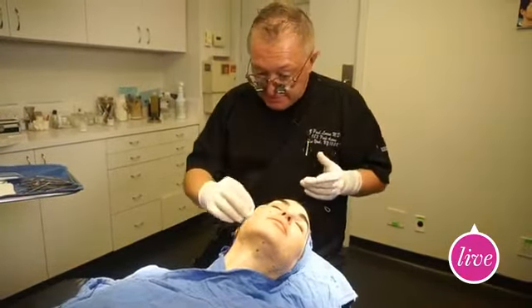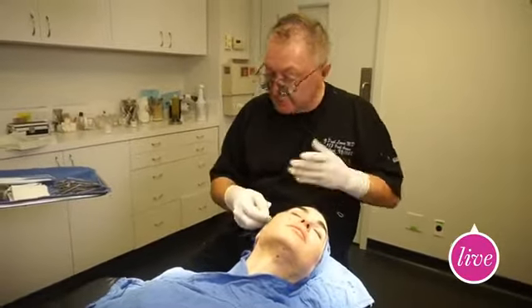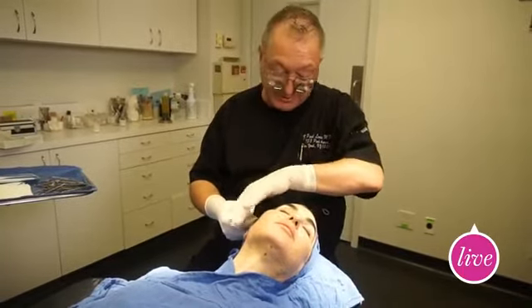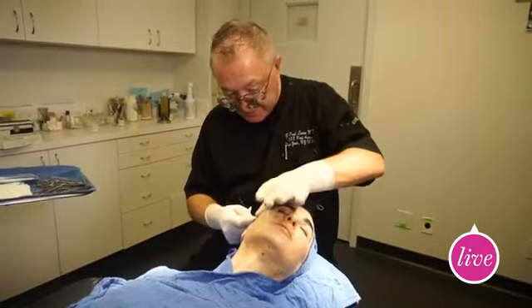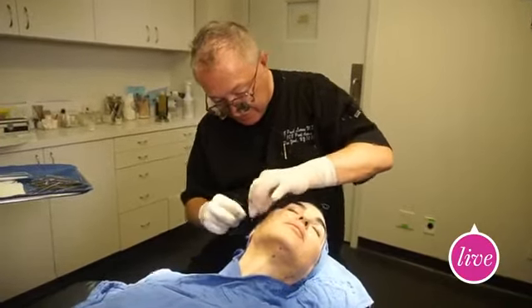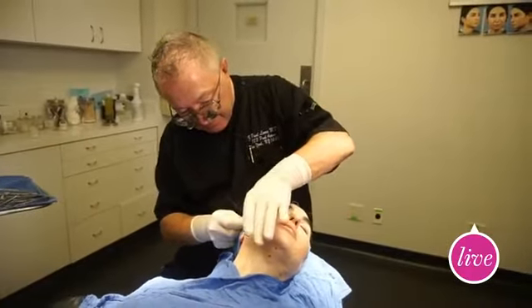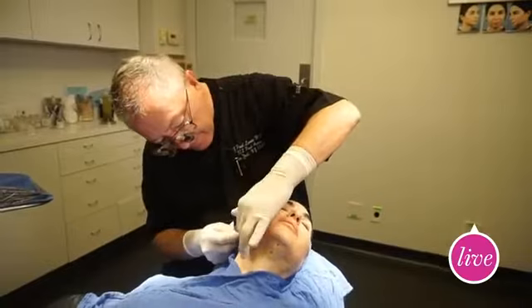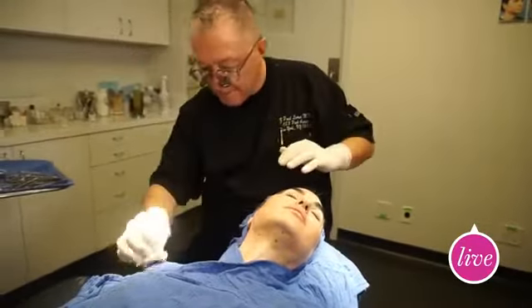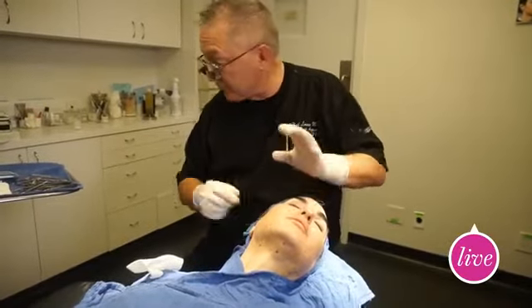So I think just for the sake of time, what I'm going to do is show you how to sort of inset or advance the tissue. Okay? Amazing. So first we'll complete the first side, and then we'll do the other side. So I'm just setting the sutures first, and this will just take a couple of seconds just to make sure that everything is absolutely flat. So you're just pressing against the sutures to make sure that the skin line is straight? Exactly, to make sure that the cones are engaged.